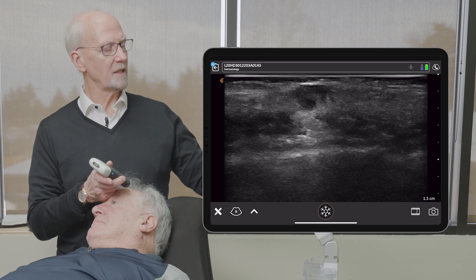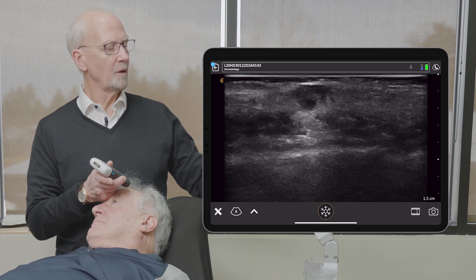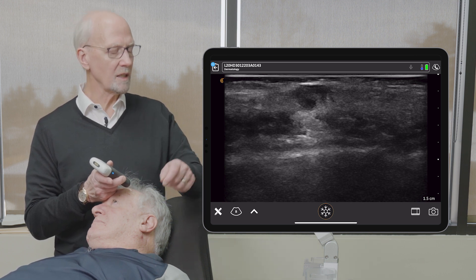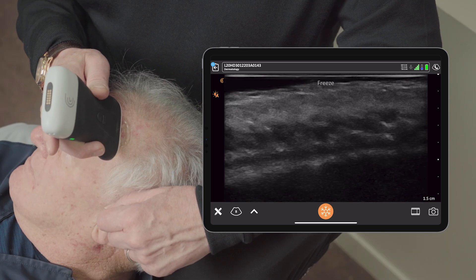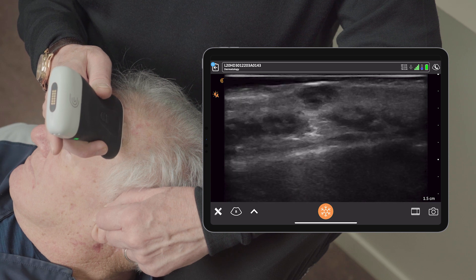We can see the surface of the skin — we have a little gel pad. We can see the lesion itself is relatively well circumscribed. Let's just look a little bit closer at that.